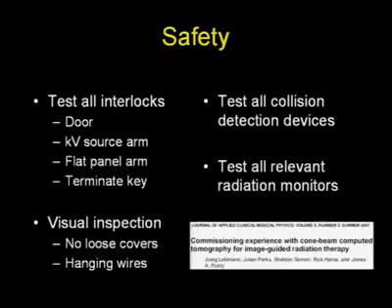And again, these interlocks not only address the touch guards or the collision detection devices, but also the door interlocks. Are they working? Is the kV source arm deployment interlock working properly? The flat panel arm deployment, and test again that the terminate key is working properly.